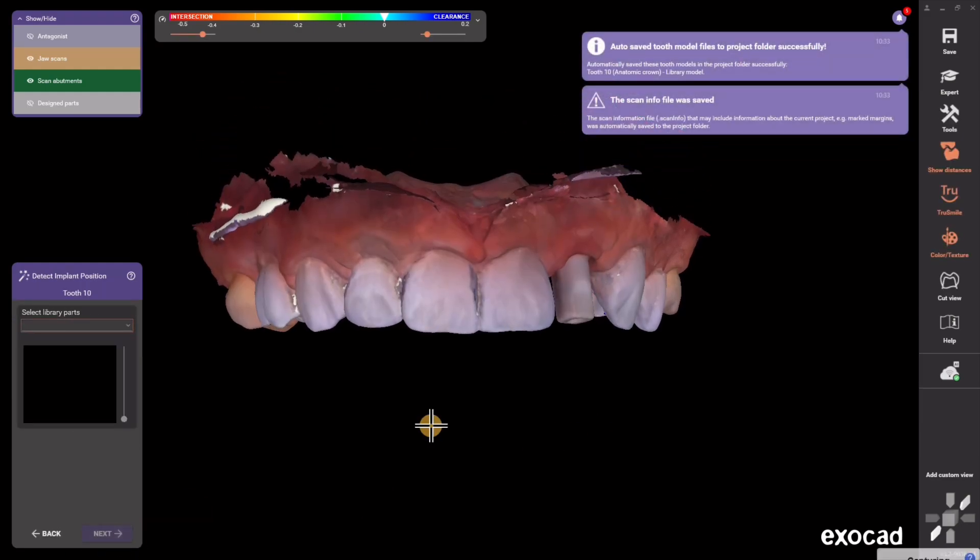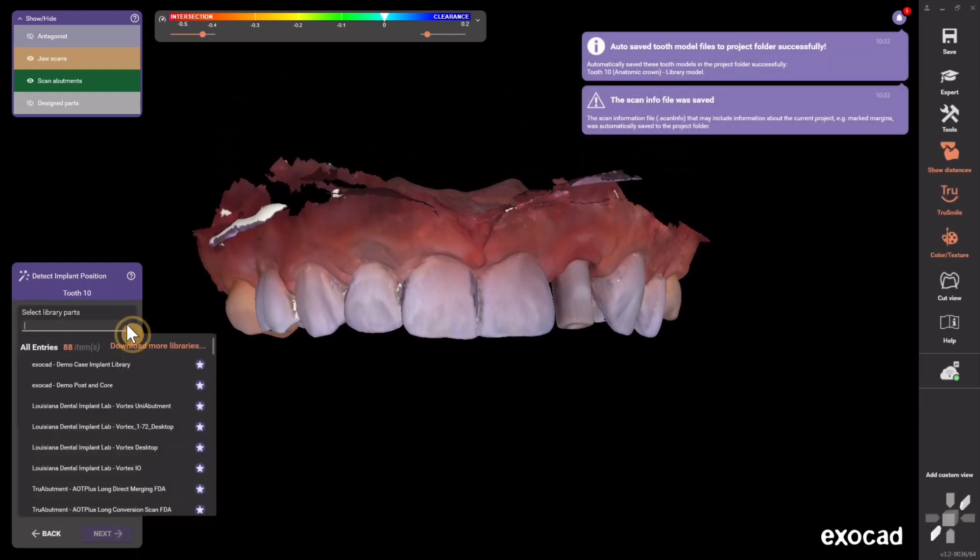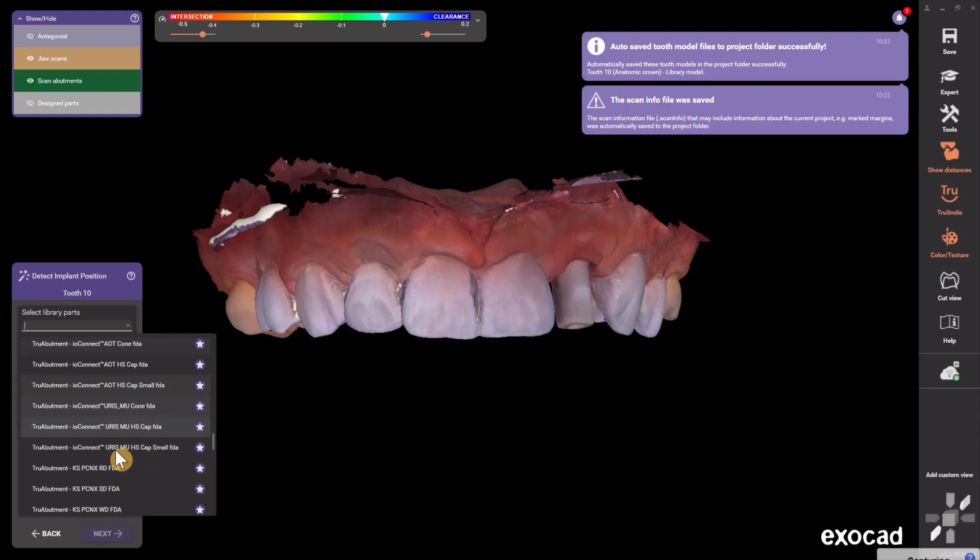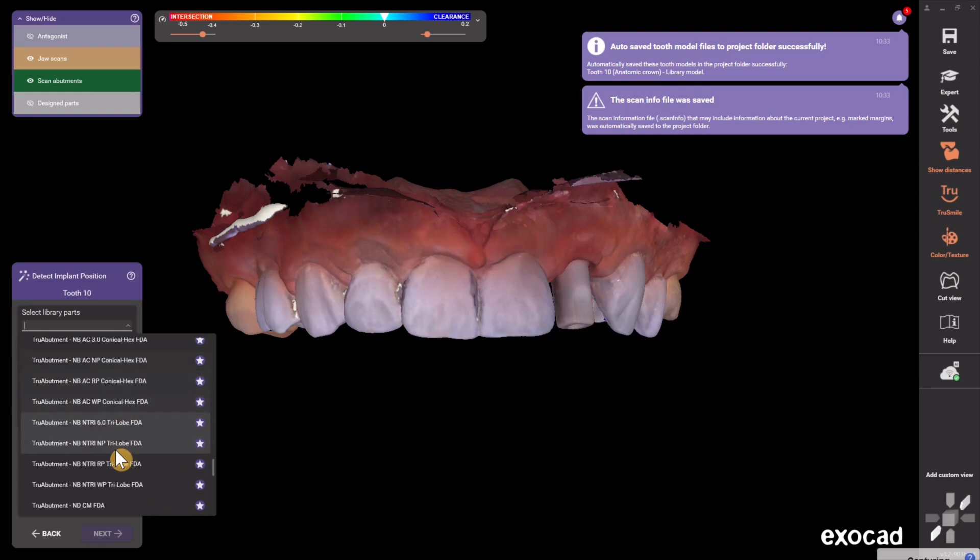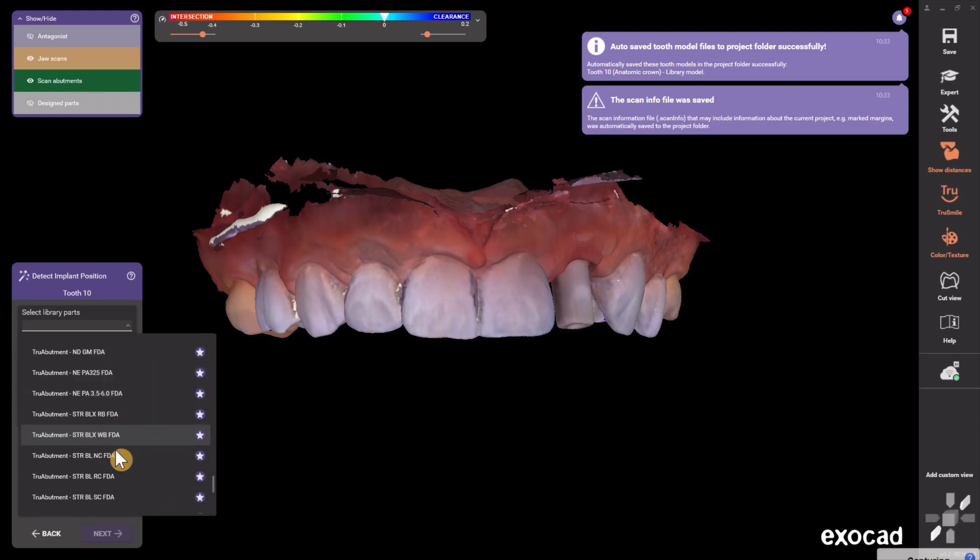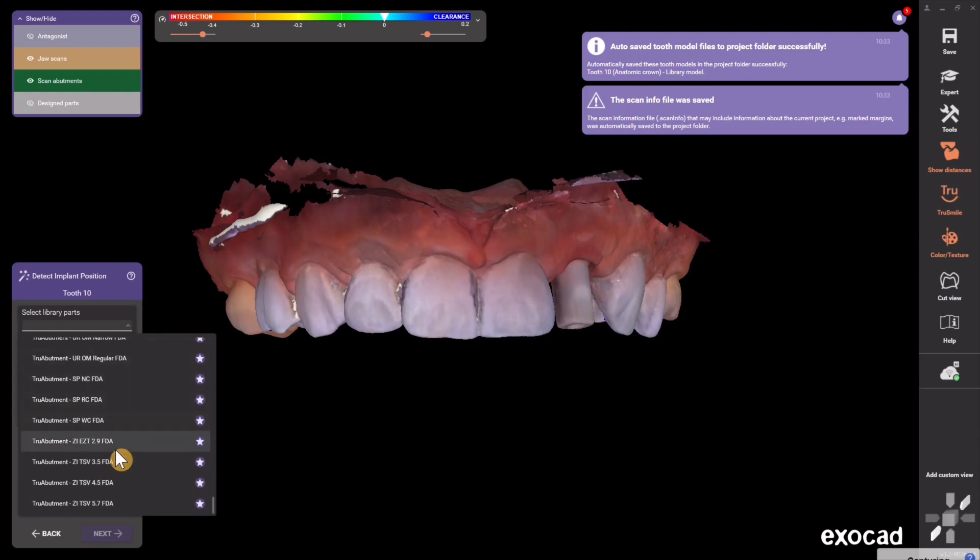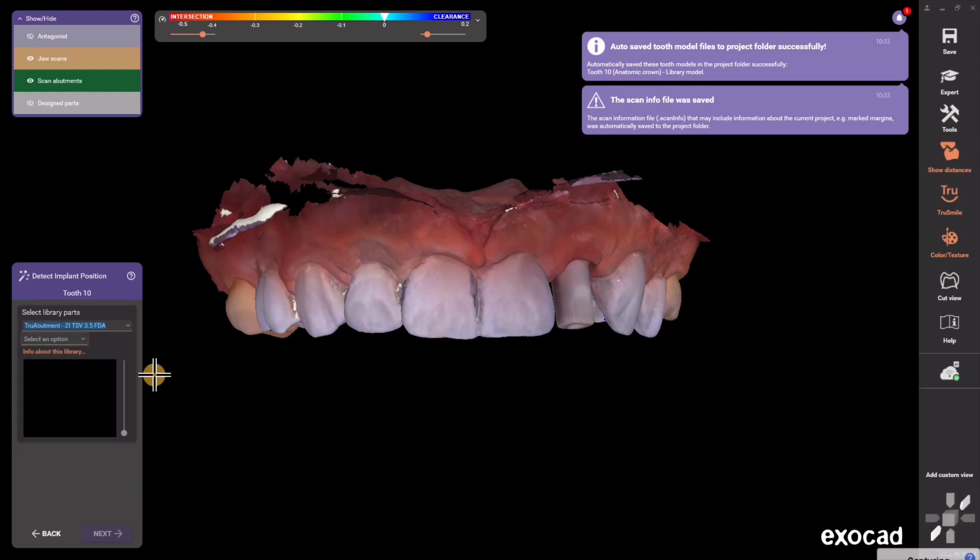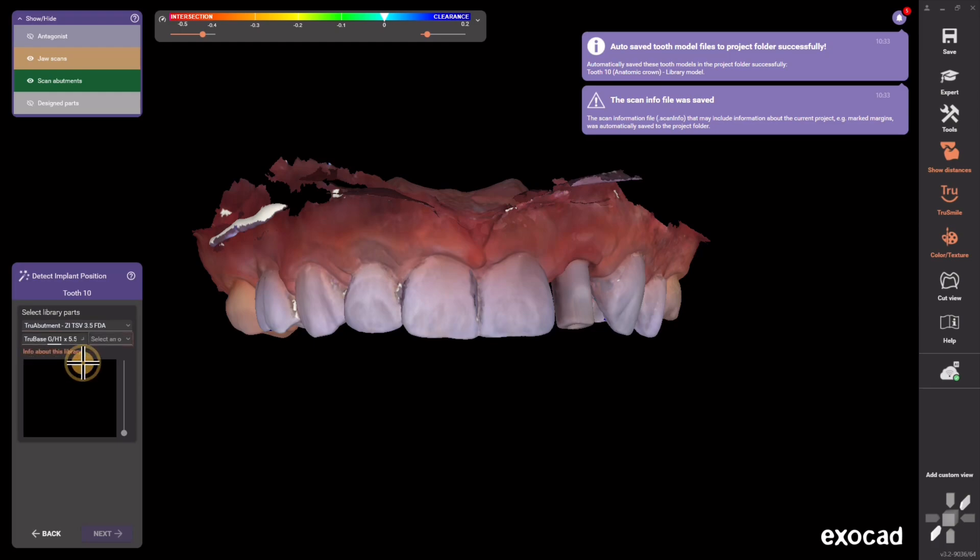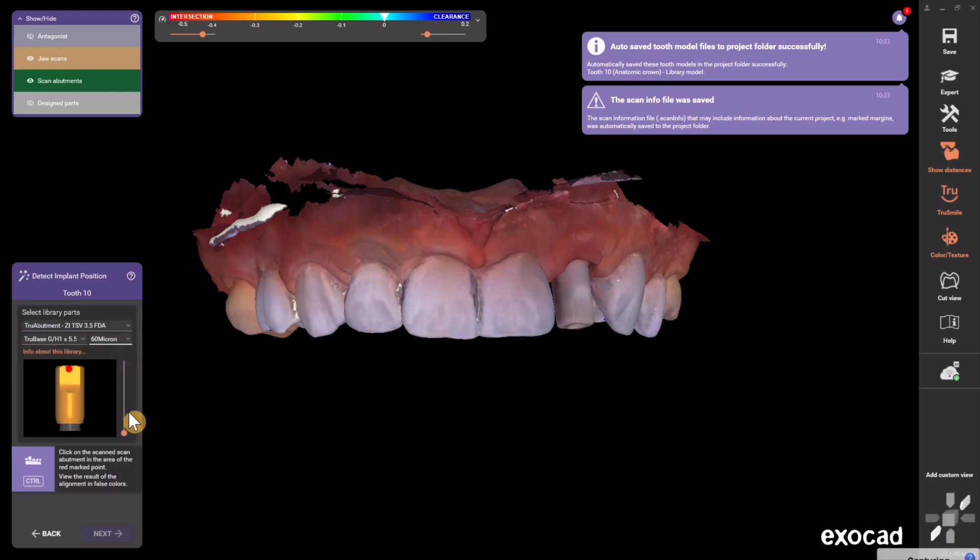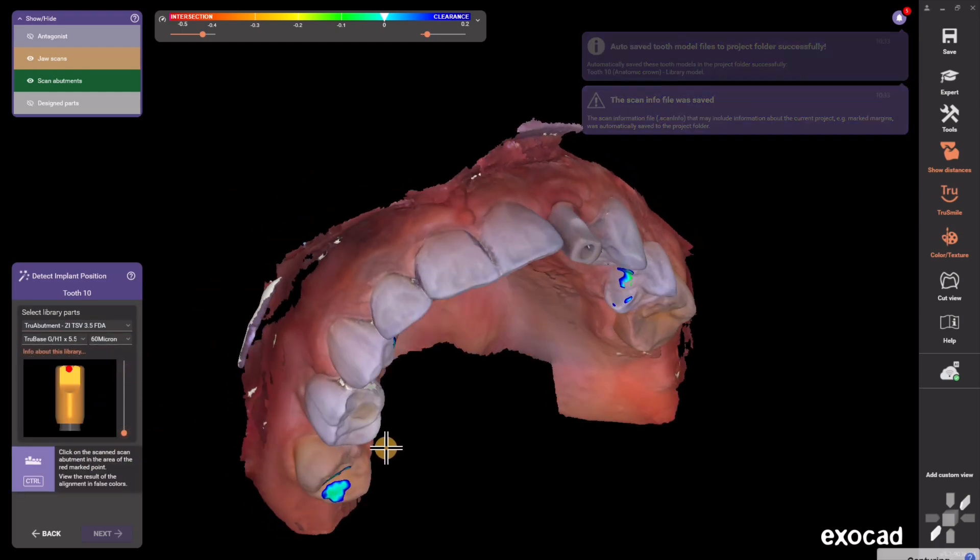So now comes the part of finding my scan body. In this case I used a true abutment scan body for a Zimmer tapered screw vent 3.5 implant, so I find that and then I select the tie base that I want to use.